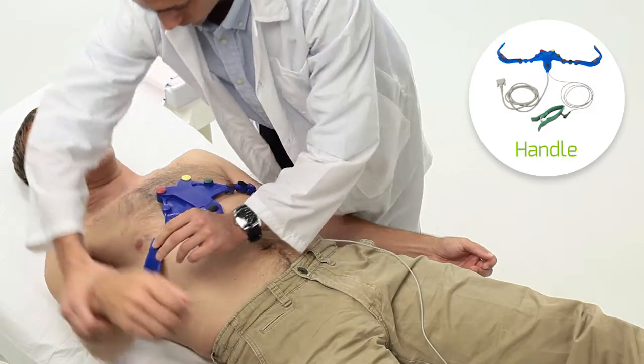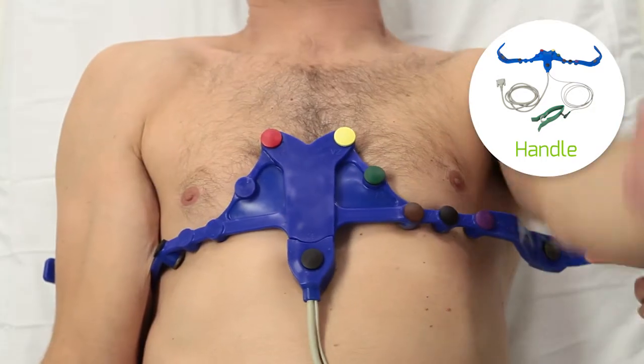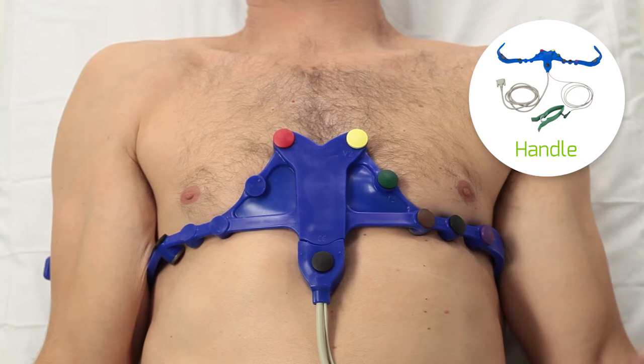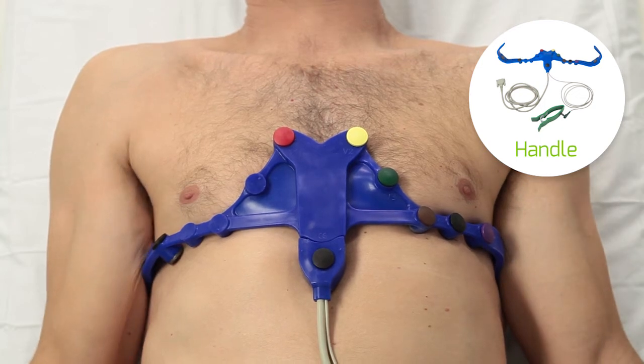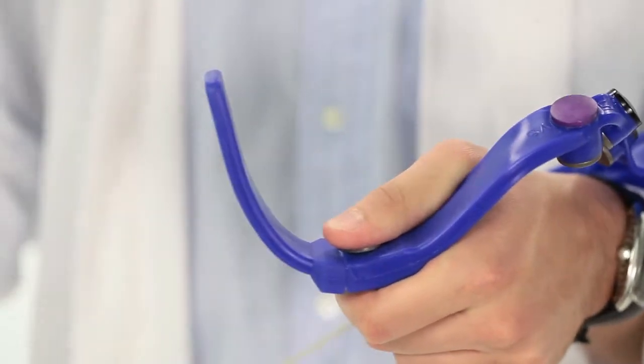If you are using the handle belt, apply the handle on the mid-arm between elbow and shoulder. If necessary, for better fitting to the arm, hold the hand electrode and adjust the handle gently.